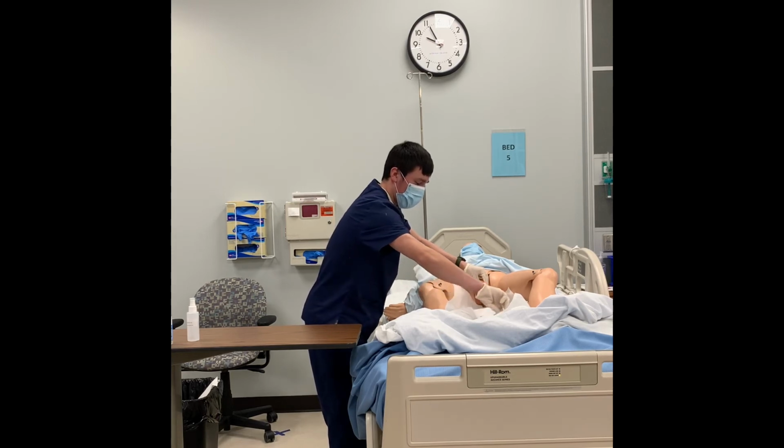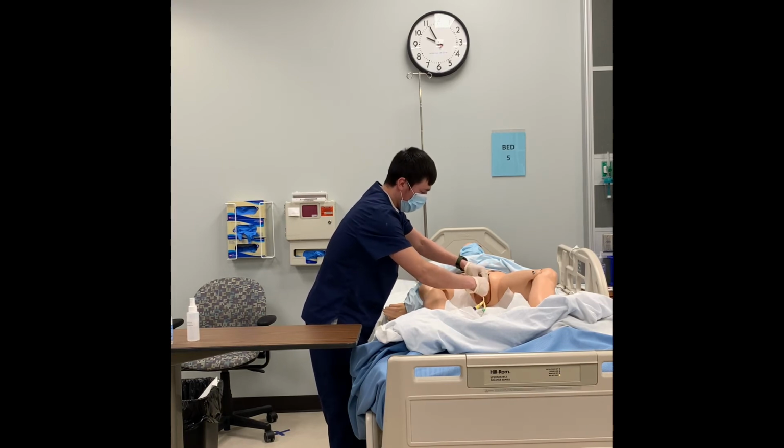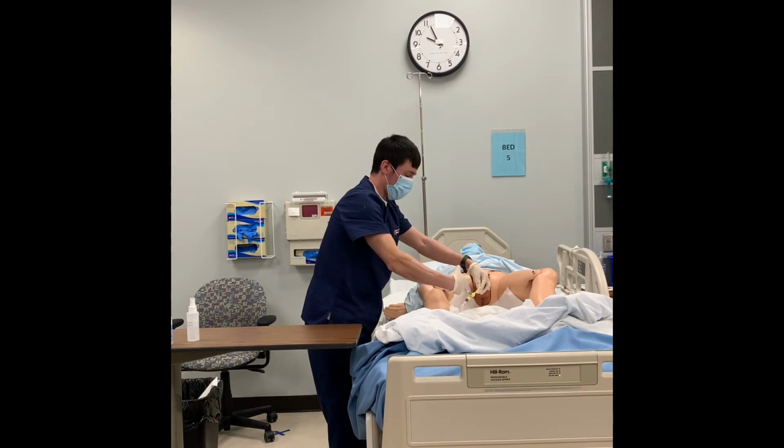Okay, so now I have my catheter. I want to coil it up a little bit, and now I'm going to insert my catheter. I'm going to insert until I see urine flash, and then I'm going to insert it just a couple inches further to ensure that the balloon is in there. Okay, so now I'm going to grab with my other hand this syringe and push the saline to inflate the balloon.